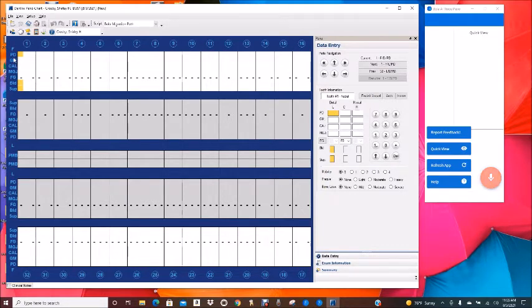545, 545, 545, 434, 434, 434, 323, 323, 222, back, 323.